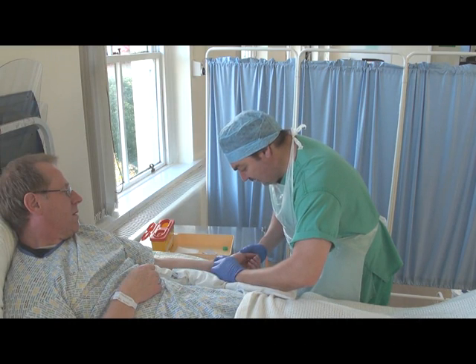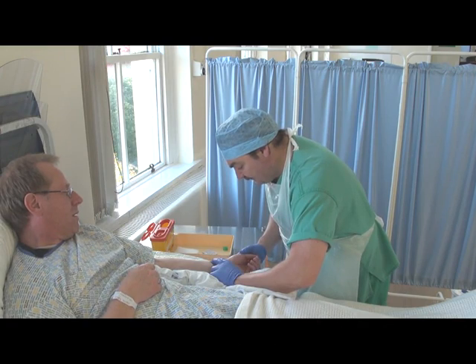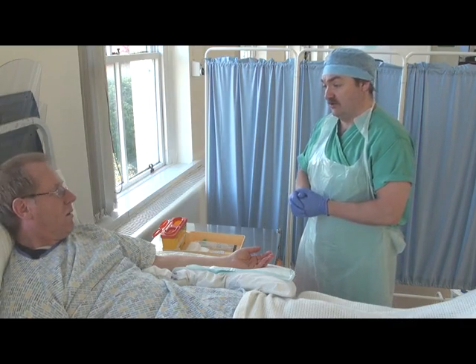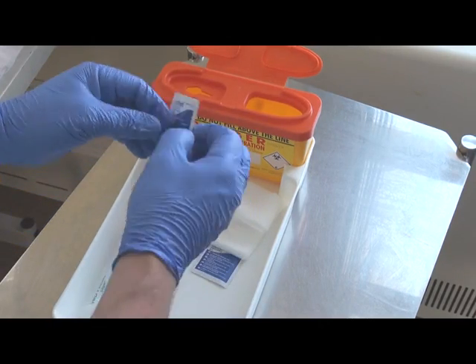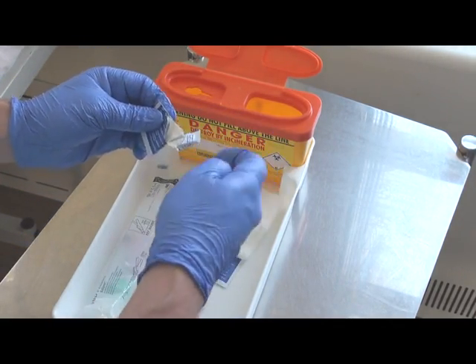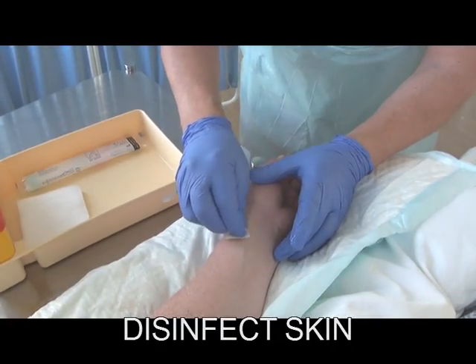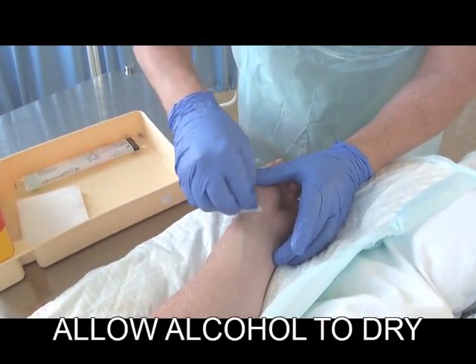Palpate the radial artery and locate the maximum pulsation point. Make sure the wrist is extended at this time. Using a chlorhexidine-containing alcohol wipe, it's important to clean the selected area. Once the area is cleansed, it's important to allow it to dry for at least 30 seconds.